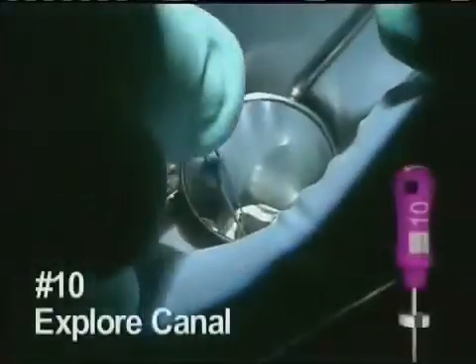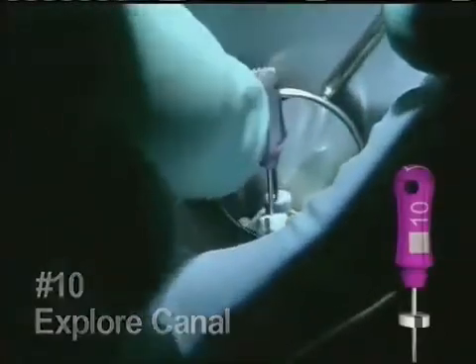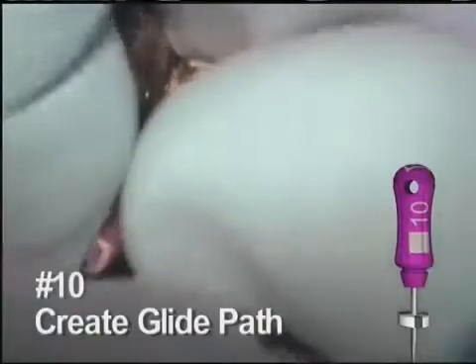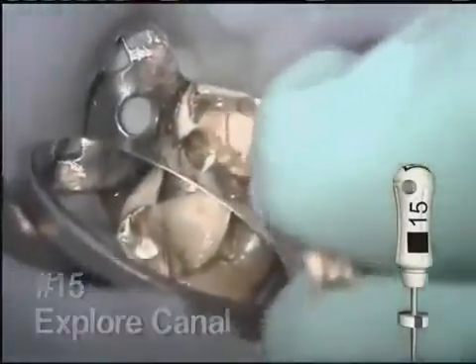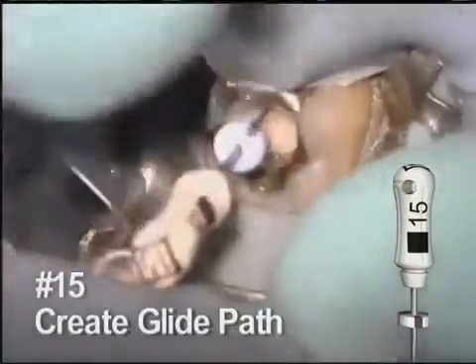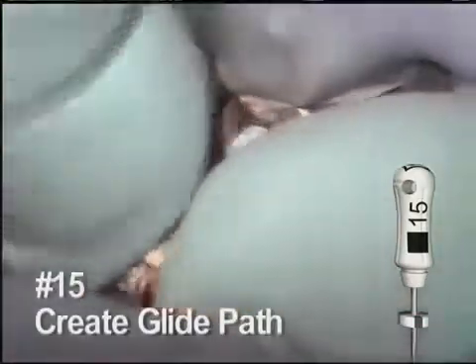Begin with a number 10 hand file. It doesn't take long to scout the canal space. This is worked to about two-thirds of the estimated depth of the canal. Based on the anatomy, the next hand file is pre-curved. This number 15 file is worked gently to create a glide path for the rotary instruments, going to about the same depth.